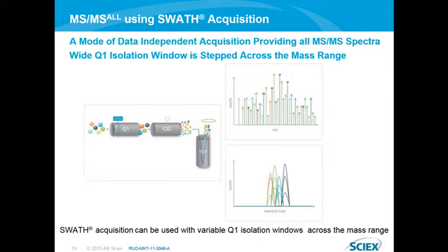interrogation. We specified a mass range for our SWATH MS-MS acquisition. Since synthetic cannabinoid masses fall between 232 and 406 Dalton, any emerging synthetic cannabinoid with a mass between 228 and 408 Dalton also will be detected via this method with a high degree of selectivity and sensitivity.